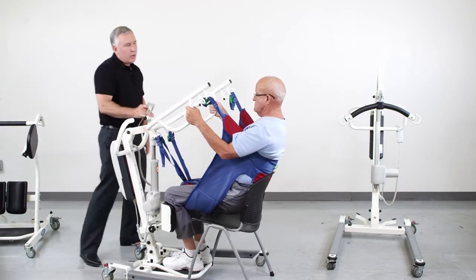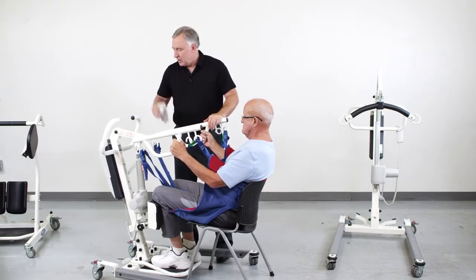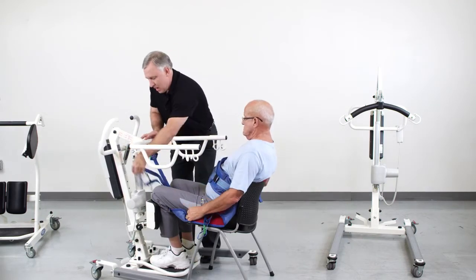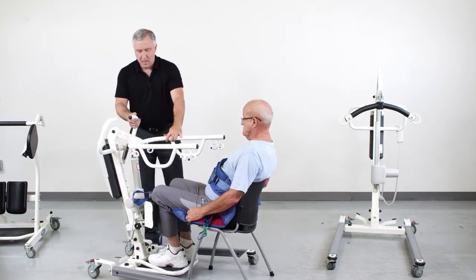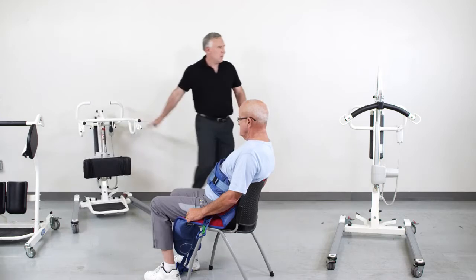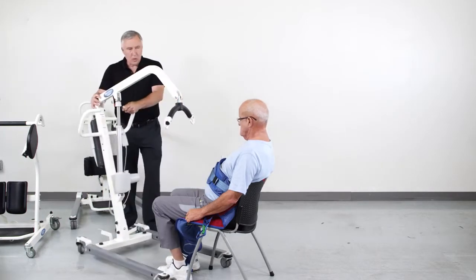But when we require complete support for the transfer, and the patient can no longer tolerate this type of position, then we move on to the full body lift to give that patient complete support. And what's convenient about the Sling is it can still be used with a full body lift for a limited period of time on a patient that requires full support.